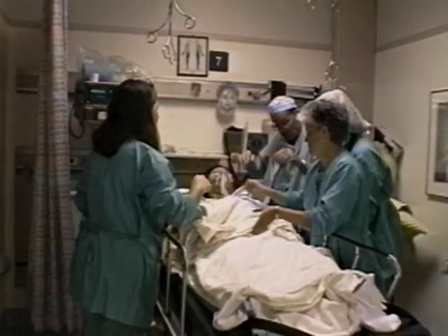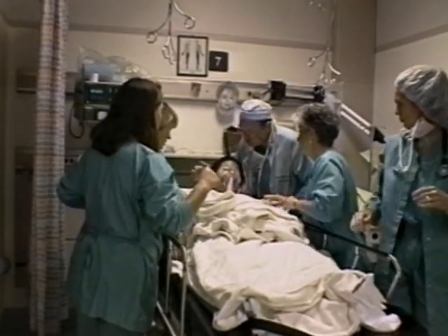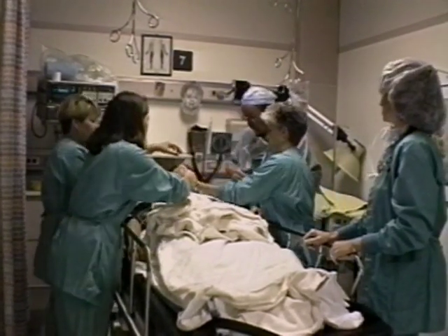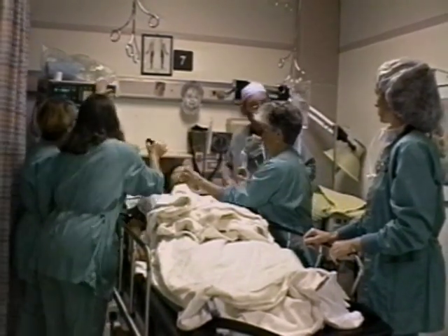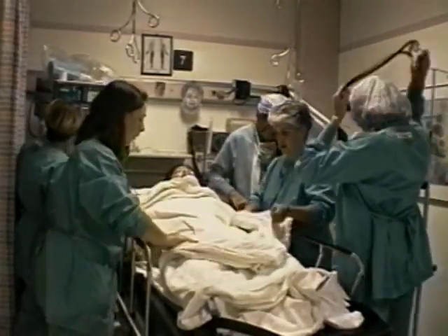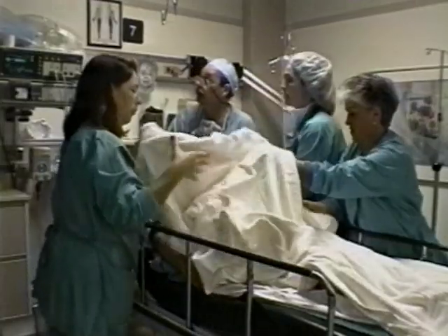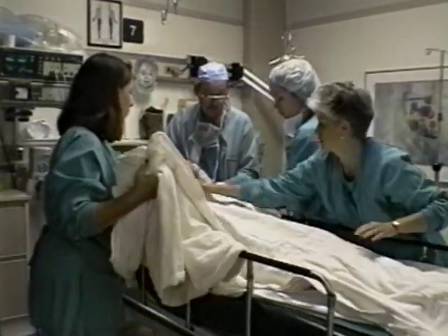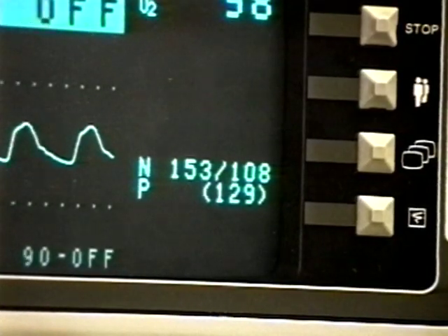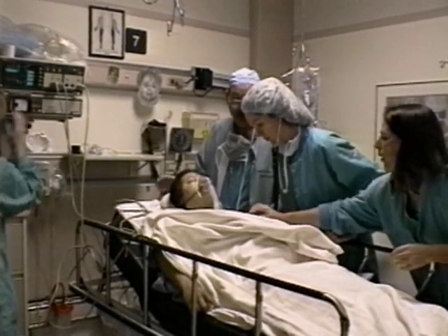This patient is recovering from an uneventful general anesthetic. Her level of sedation and her morbid obesity put her at increased risk of airway obstruction. Despite the distractions, watch how her care team stays focused and continually reassesses her status. The anesthesiologist evaluates breath sounds, vital signs, and oxygen saturation. Her saturation is lower than normal. Her blood pressure is high. She's breathing slowly and shallowly.